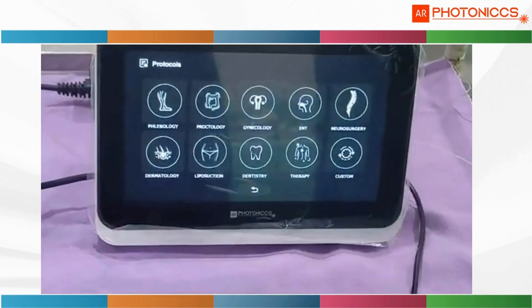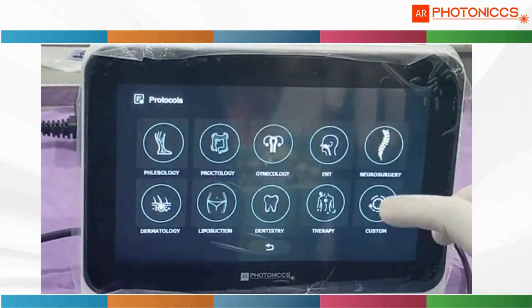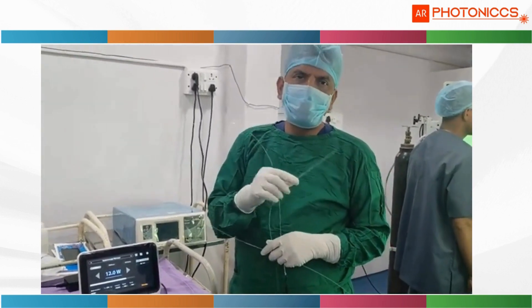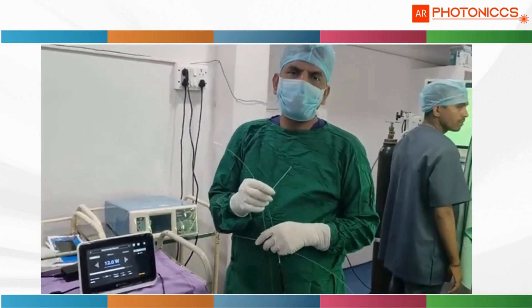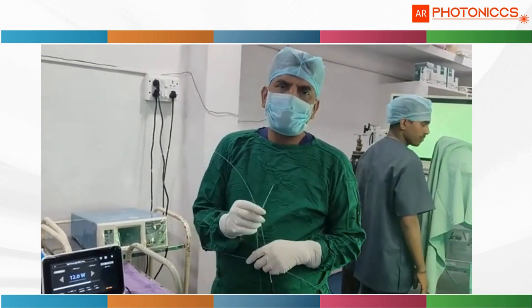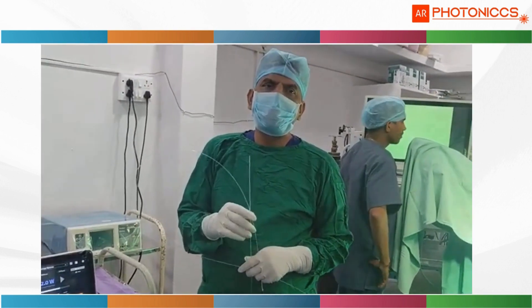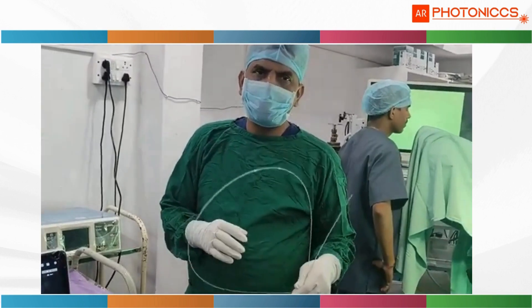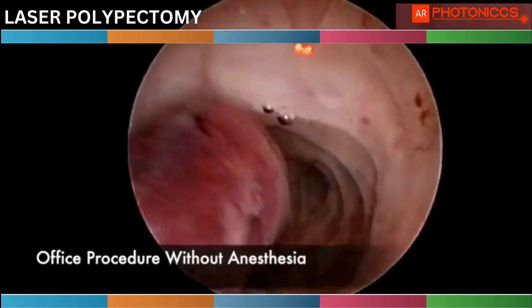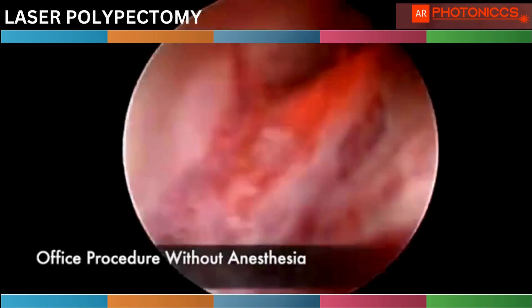That is the reason we always prefer diode laser energy for intra-uterine pathology. You see this fiber — it is a 1000 micron size, which is double the fiber size used in varicose veins and proctology. The size is bigger and it fits the five French range.